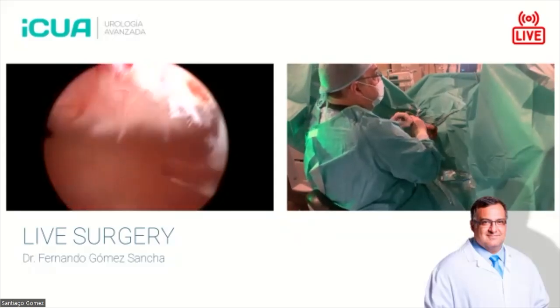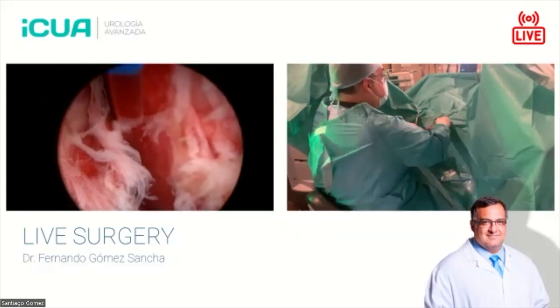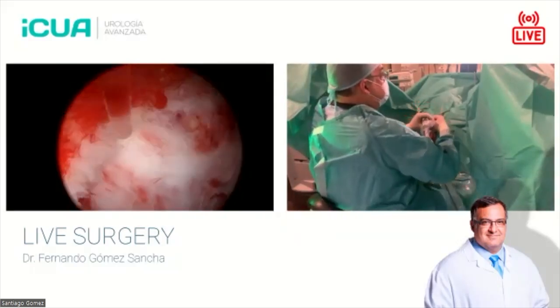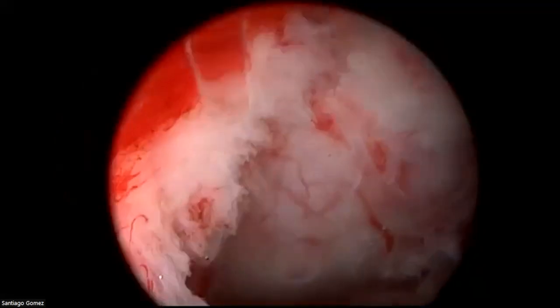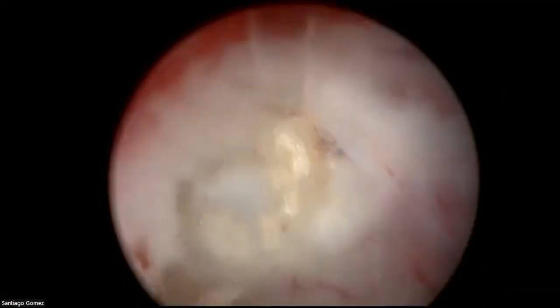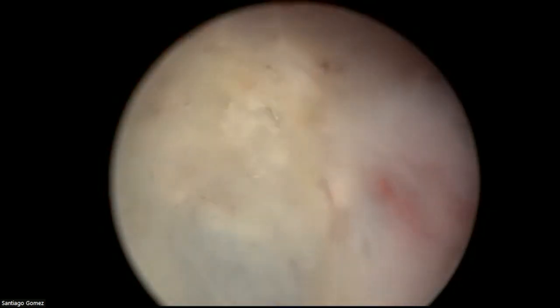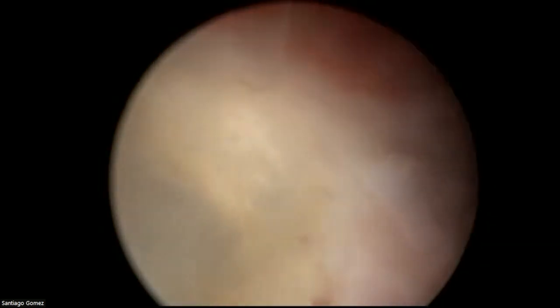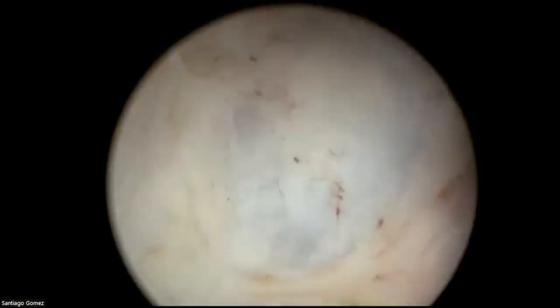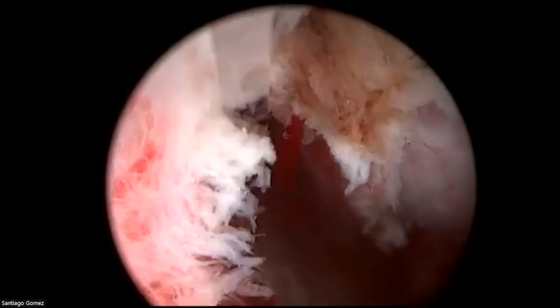Okay, so now that I did some of the posterior liberation, I'm going to come to the apex. You see here, I see my white line. This is the sphincter. As the first step, I'm going to deepen the white line. Here you see I'm deepening the white line a little bit because I want better access. These are also called access lines.